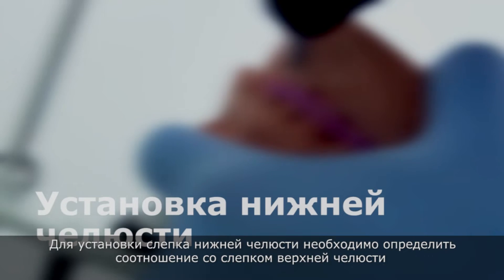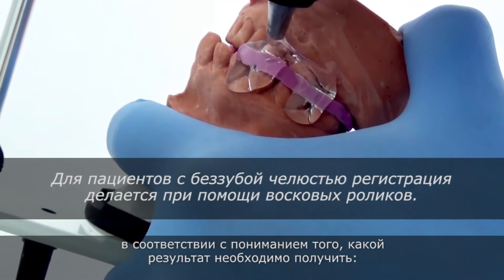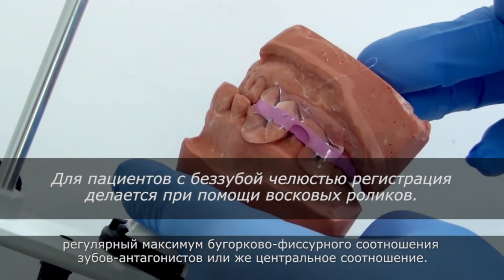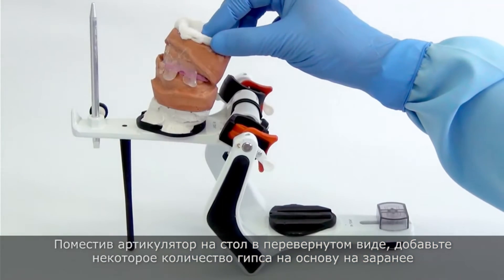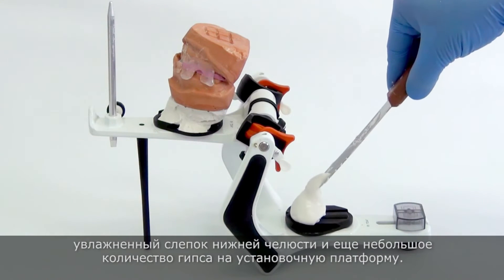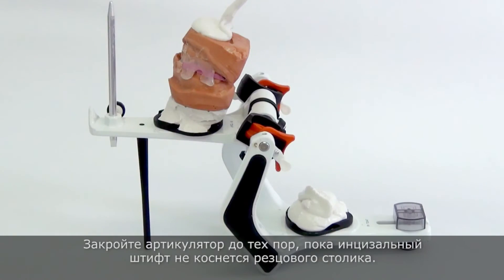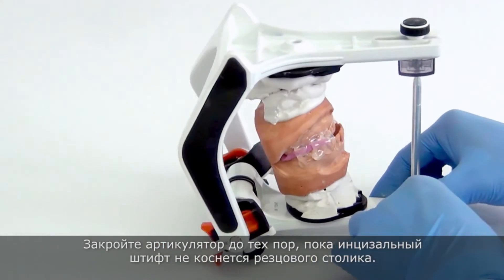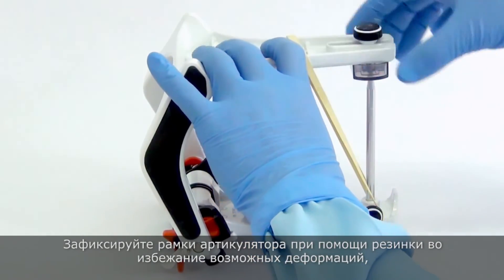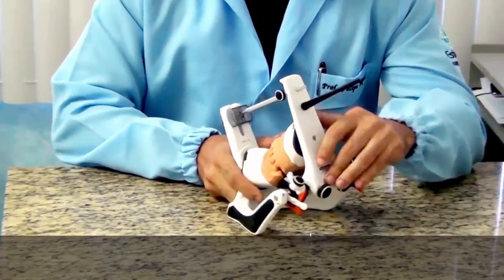To mount the lower cast, it is required to relate it with the mounted upper cast, according to what is intended — either regular maximum intercuspation or centric relation. With the articulator inverted on the table, add a portion of plaster on the base of the previously hydrated lower cast and another portion on the mounting plate. Close the articulator until the incisal pin gets in contact with the incisal table. Fix the articulator's frames with a rubber band in order to avoid possible distortions caused by the plaster expansion.